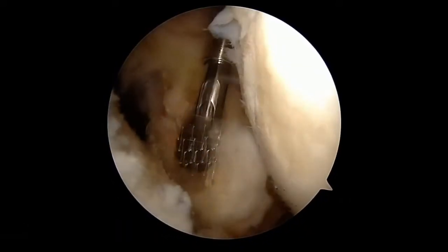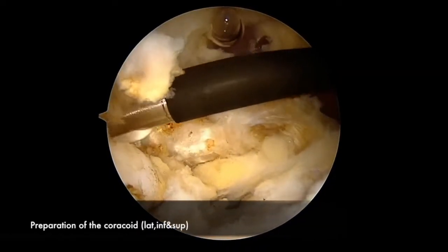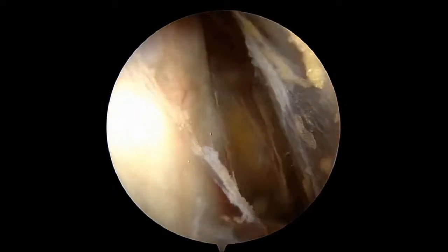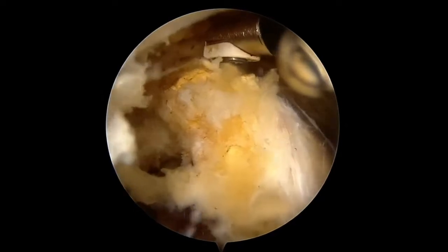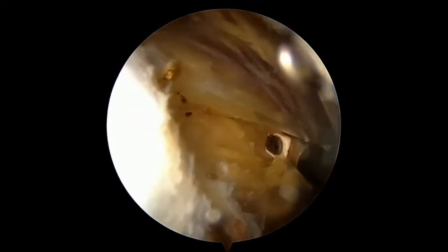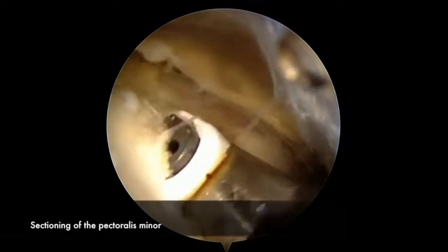At this point, the rotator interval is removed and the base of the coracoid is visualized. The scope is then transitioned into the anterolateral portal and the conjoint tendon visualized. Soft tissue is debrided from the superior aspect of the coracoid and the pectoralis minor tendon is identified medially. Using the radiofrequency ablation probe, the pectoralis minor tendon is removed from the medial aspect of the coracoid base.